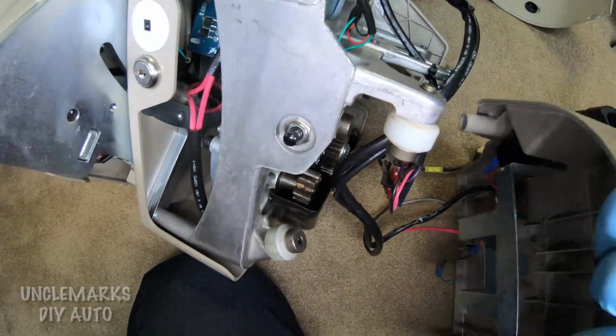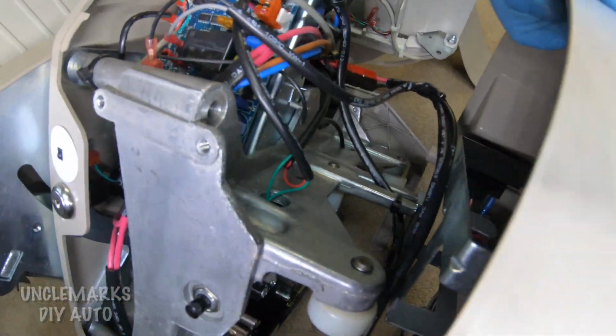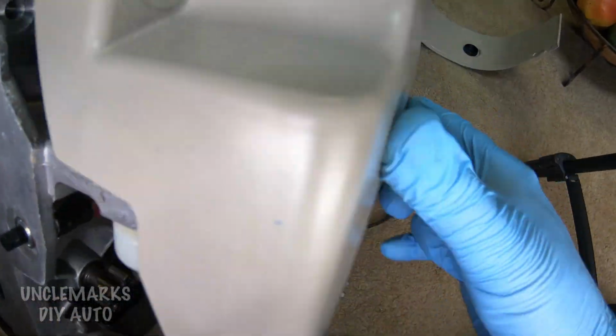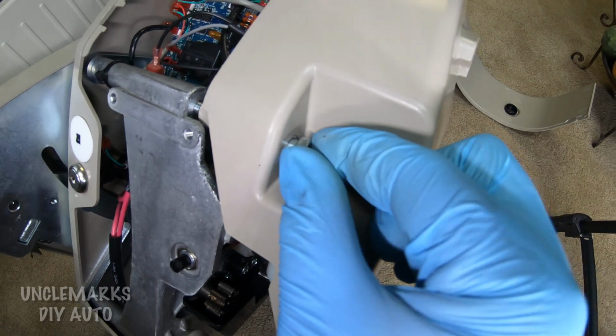put it on the rail first, and then put the batteries in, get it to move a little bit, make sure the wires aren't being pinched or going to get run over by the rail. A lot of fun trying to put this back on with one hand, but it's just good to see how this all goes together.